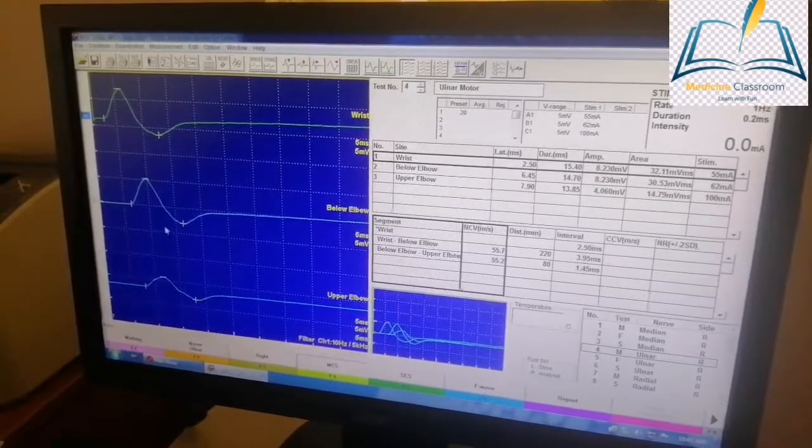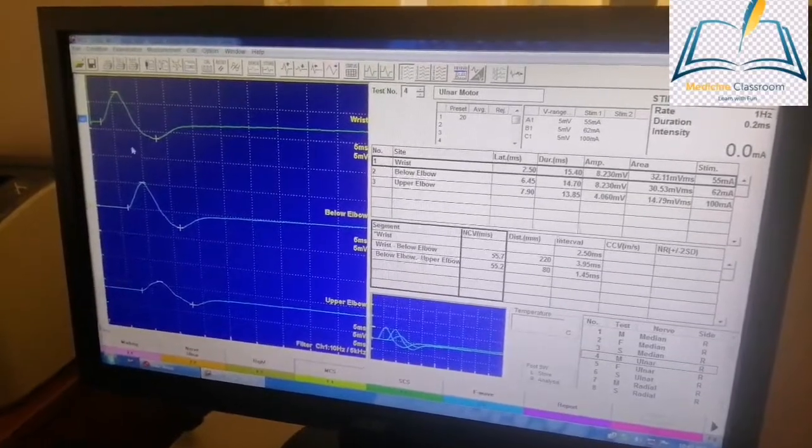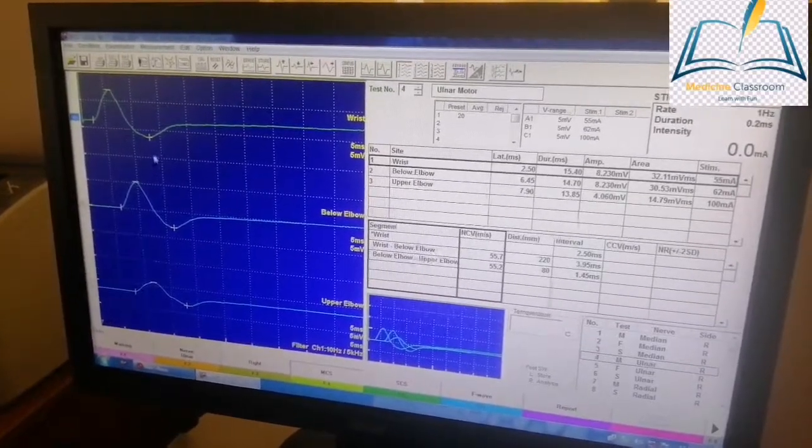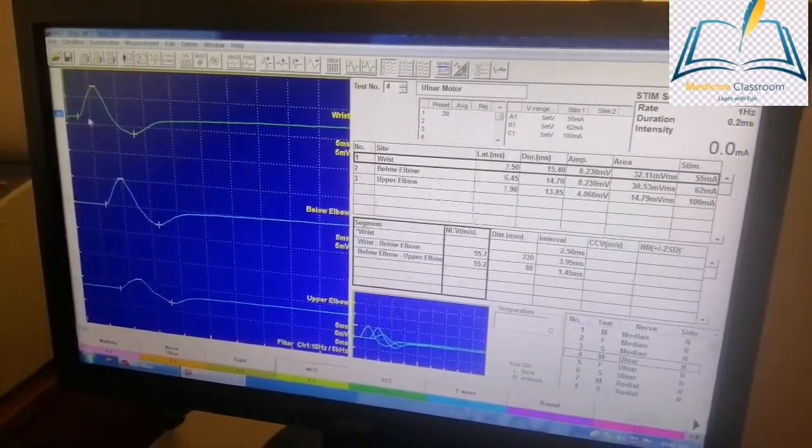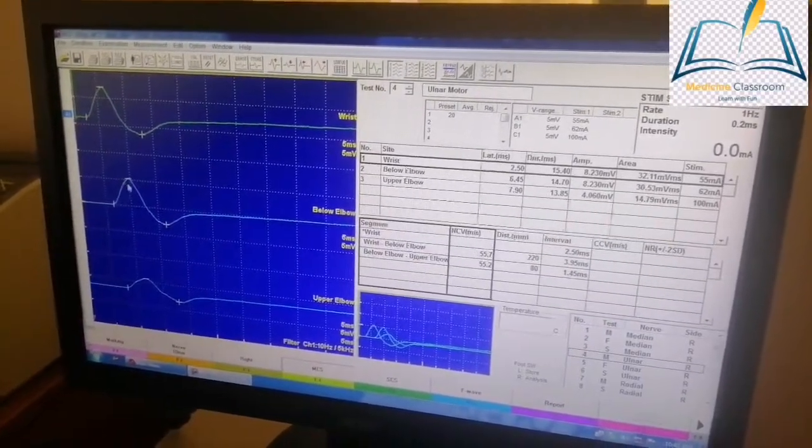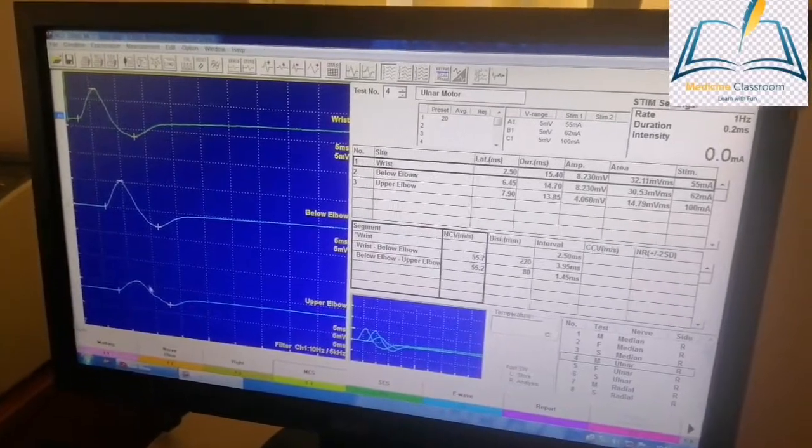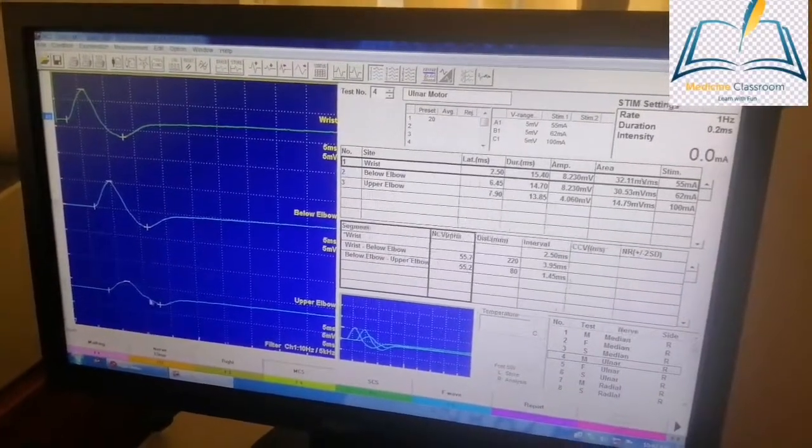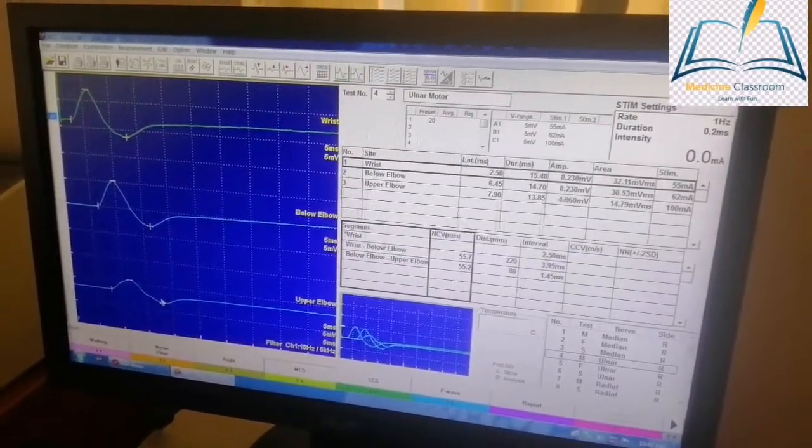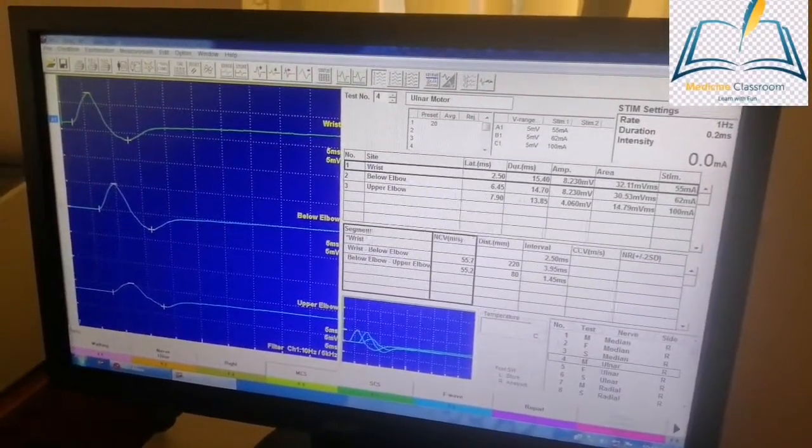So till now we have seen there is no increase in distal latency, but there is the feature of conduction block as well as temporal dispersion.